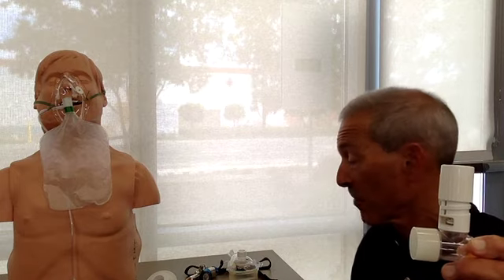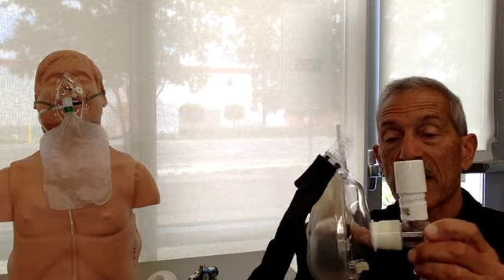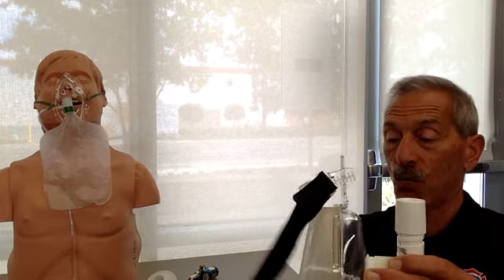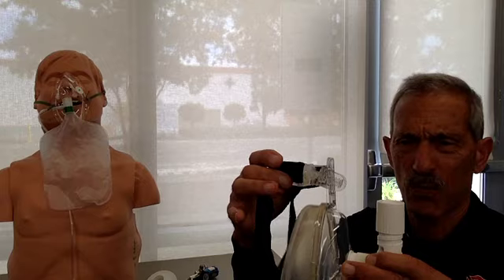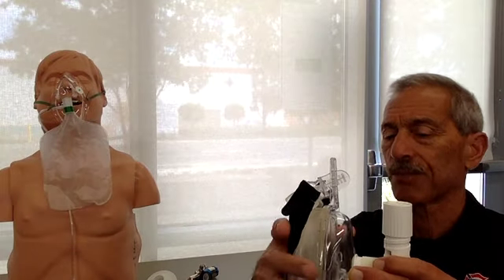Kind of makes sense. The mask itself just attaches right onto here, and it's ready for application. There's some straps that go around the back of the head and along the jawline and clip down the lower part of the mask as well, around the back here. There's a pad for their forehead. It's adjustable up and down to adjust for comfort, because these are not super comfortable, unfortunately. Again, these are one-time use devices.